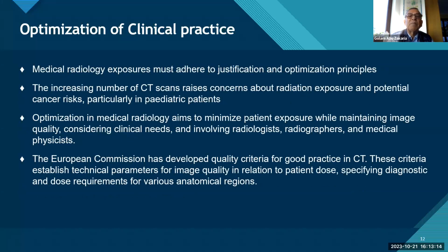Medical radiation exposure must adhere to the principles of justification and optimization. Justification is actually for the medical doctors, whether CT is needed in this case or not. When not needed, you advise the patient to go to other modalities like ultrasound or MRI. The increasing number of CT scans raises concern about radiation exposure and potential cancer risks, particularly in pediatric patients. Yes, it is a high dose because we do many slices in the body.